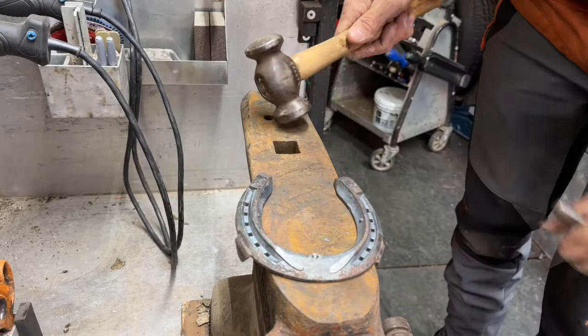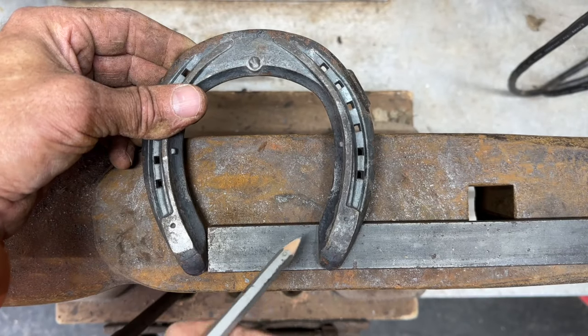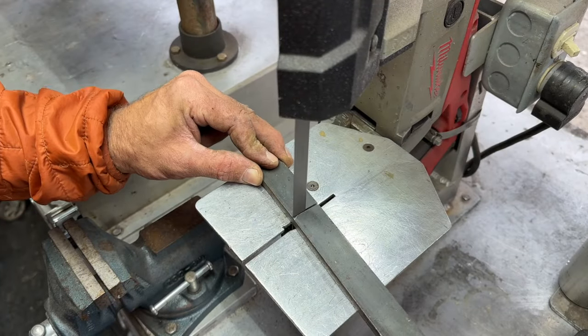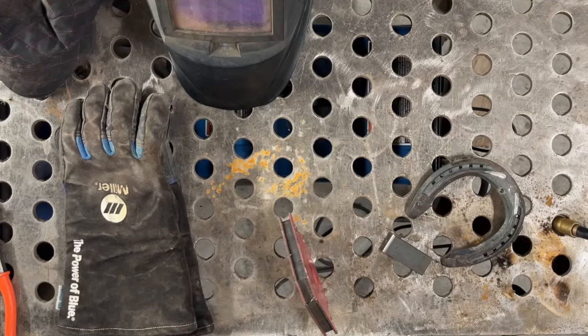I started by doing a heavy punch on the inner rim of this Avanti shoe. After shaping the shoe, I cut a piece of quarter by one inch bar stock to fit between the heels. I then put a chamfer or bevel on the end of the bar stock so that the weld could fill in the groove nicely.